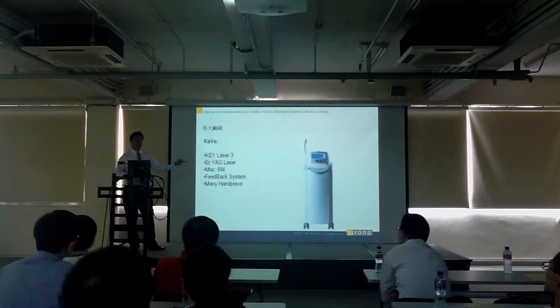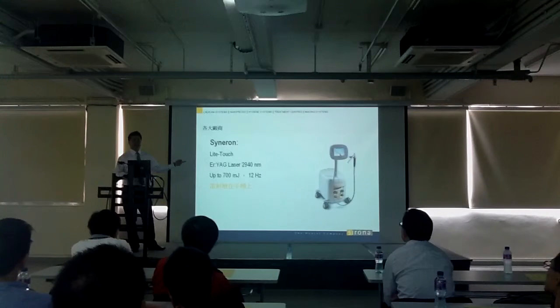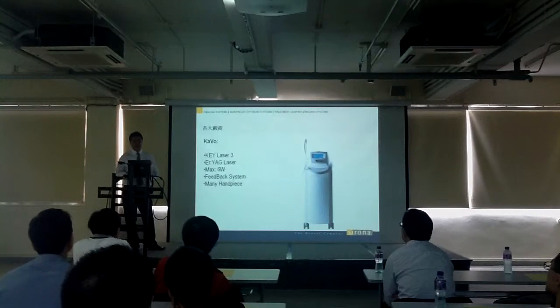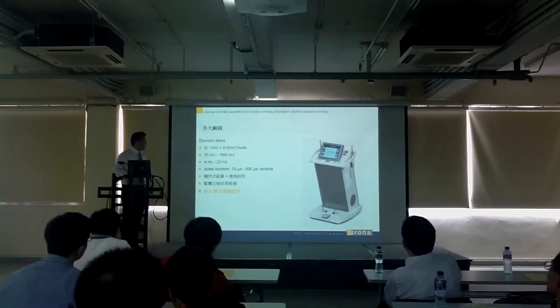That one is over 1 million Hong Kong dollars. That one is about 500 something thousand. But a diode laser is 10,000, about 50,000. So huge difference in price. You really have to think what you want to do with the laser.